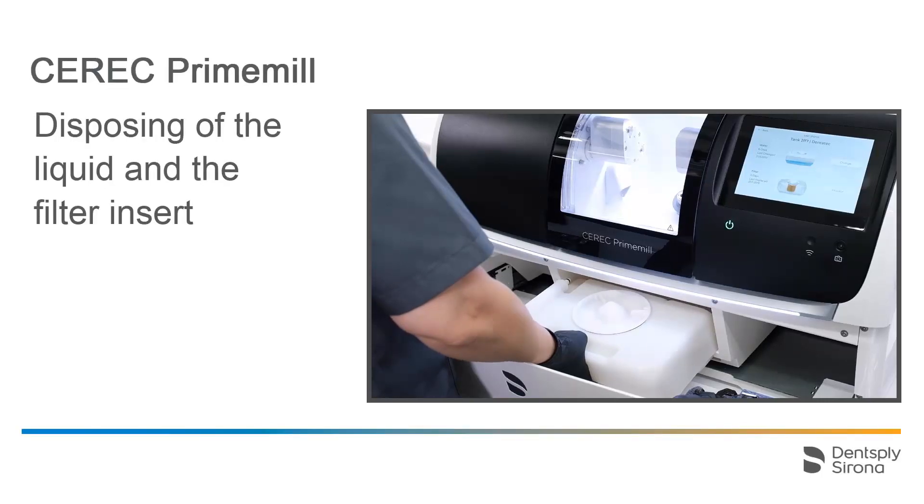In our case, we will change both the liquid and the filter insert. Dispose of the container contents according to local, regional, national, and international regulations.